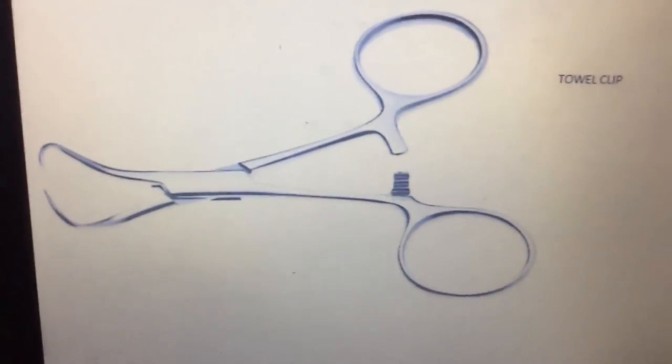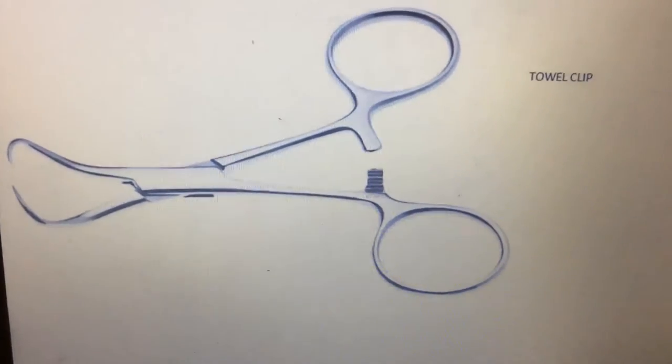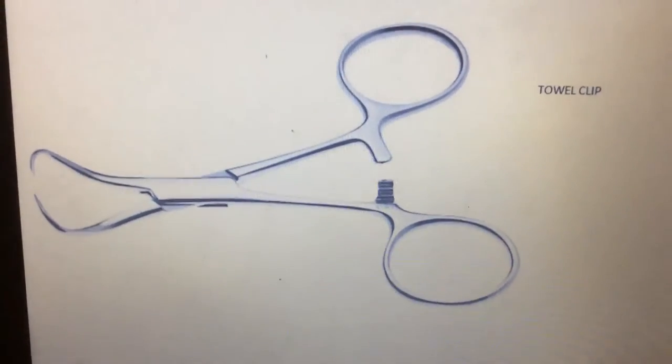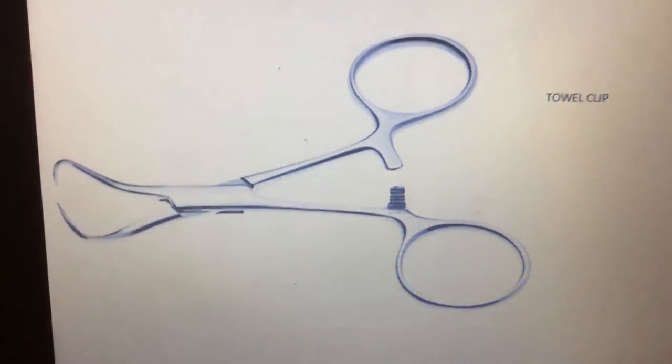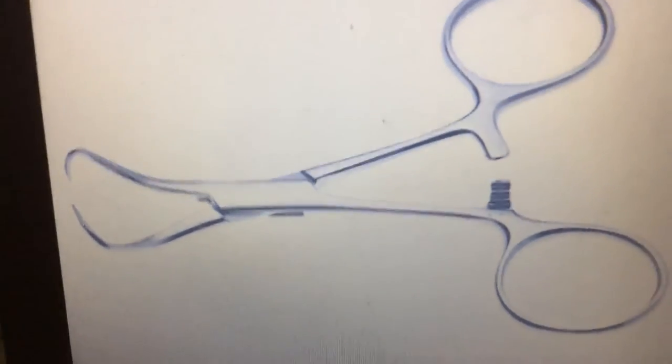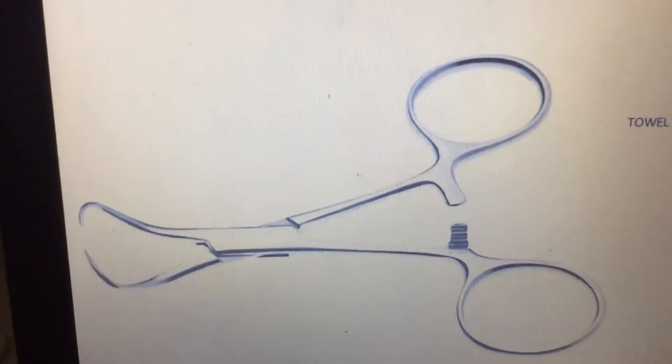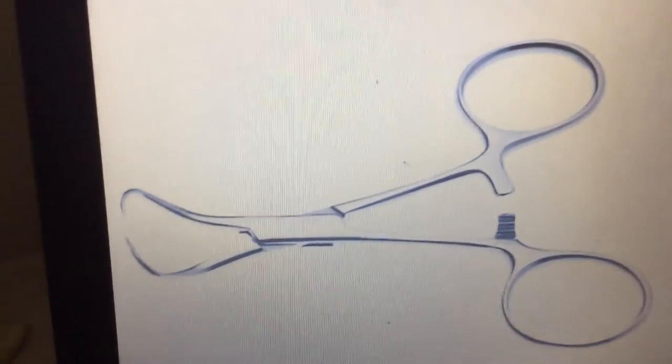Next, this one is the towel clip. The towel clip is mainly used for holding towels and drapes. Here you can see the curved needle-like tip, which is used for holding the cloth or towel.